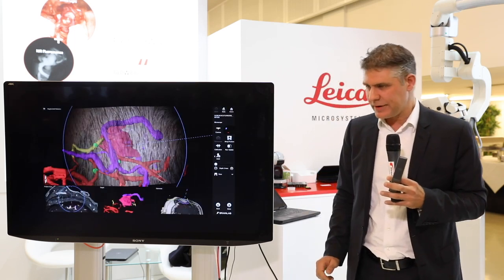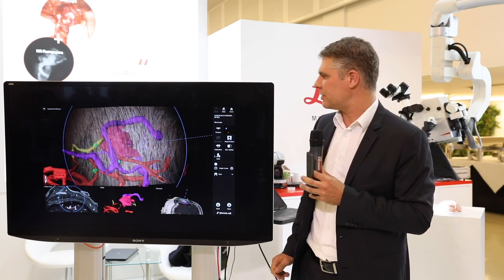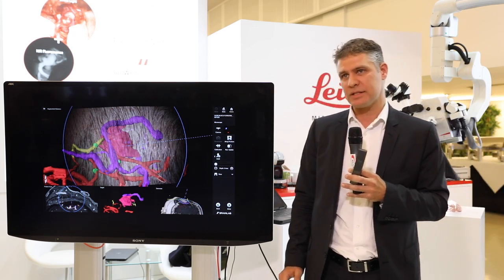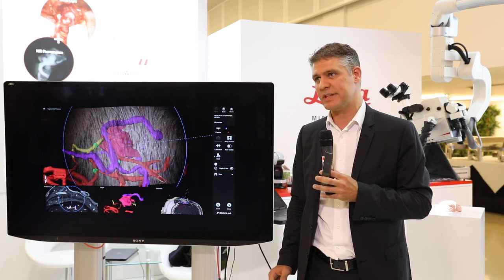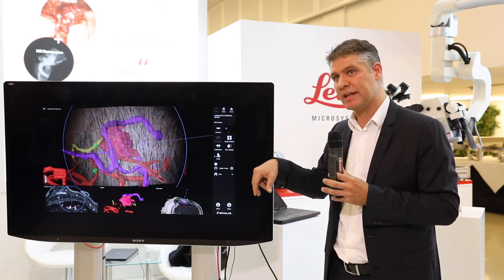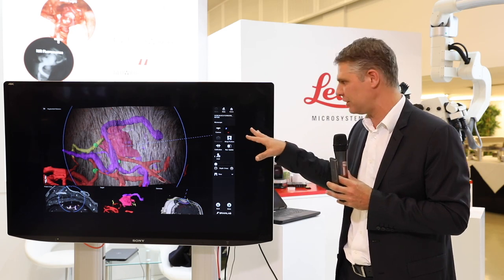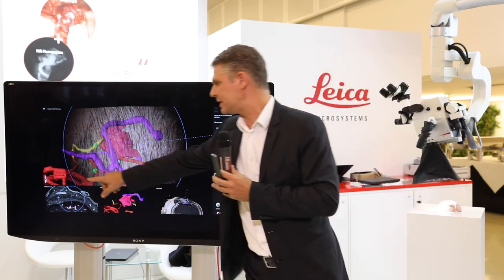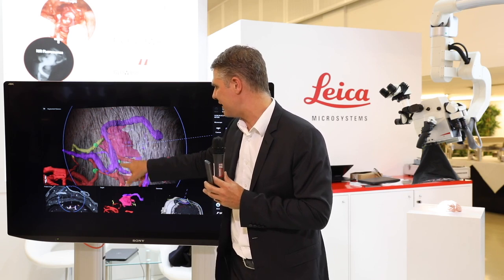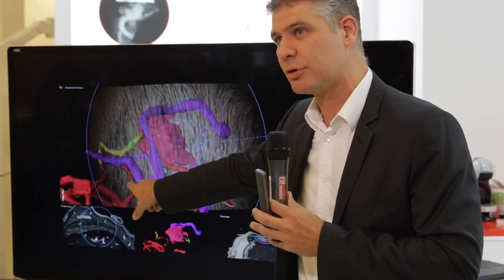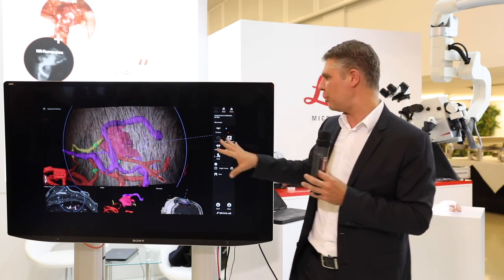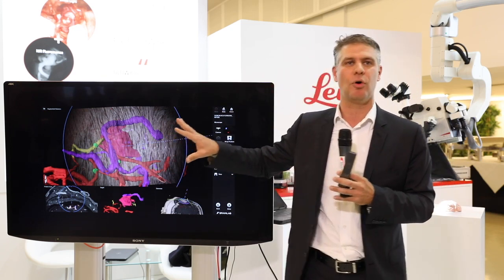This is a case of an AVM. In red is the AVM nidus. In yellow is an en passant vessel — a vessel that goes around the AVM, with some branches feeding the AVM but also feeding normal tissue. There is the sylvian artery with a feeder to the AVM, a proximal superficial branch. You can have a full understanding of the AVM before you operate, before you open the skin.